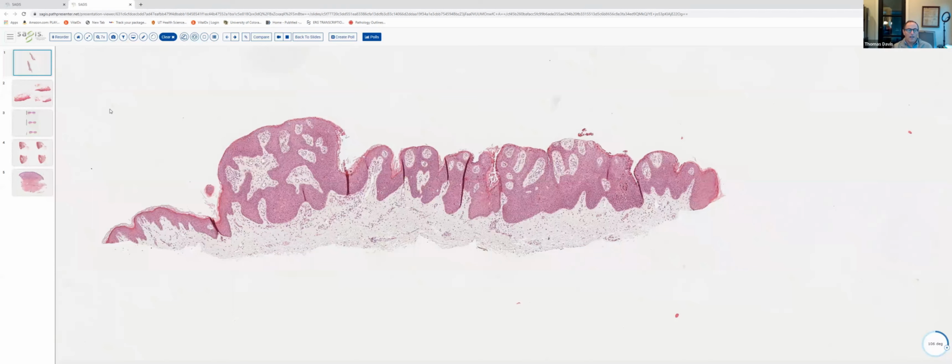And so again, having the clinical knowledge that this was one of several small pink to slightly pigmented papules clustered around the glans penis of a young male certainly would help you out. HPV typing was done on this case, and of course, there was high risk HPV identified. This particular case showed HPV 16, which is a common player in lesions of Bowenoid papulosis.